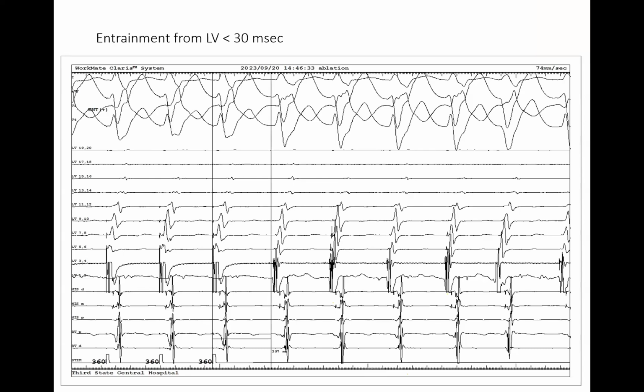Okay. I'm going to add one more comment. Even though you may present with just one fascicular VT, many young patients may have more than one form. We found at least so far more than 3 patients who had all 3: anterior, posterior, and mid.